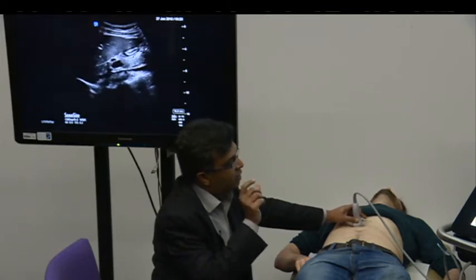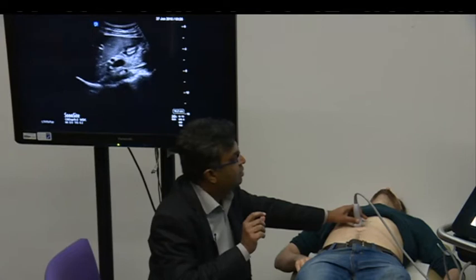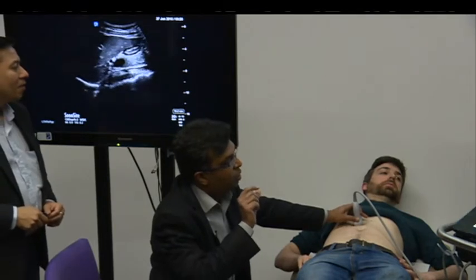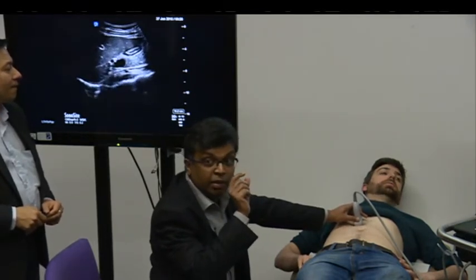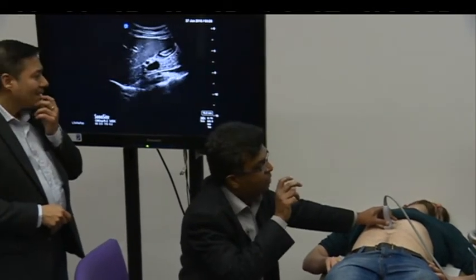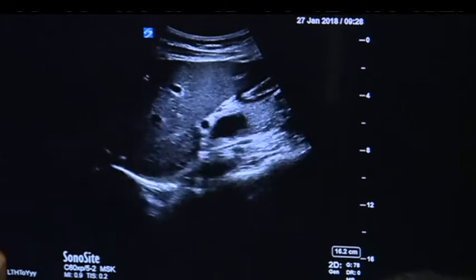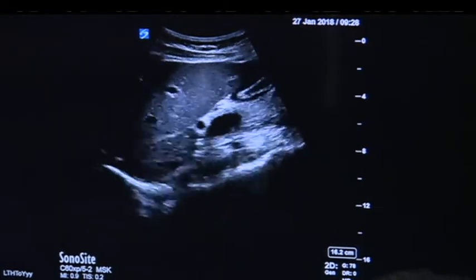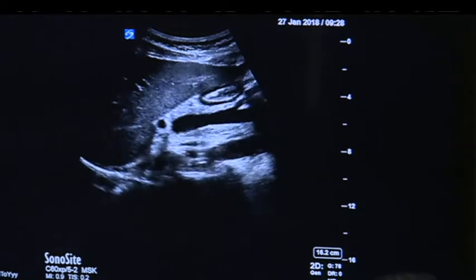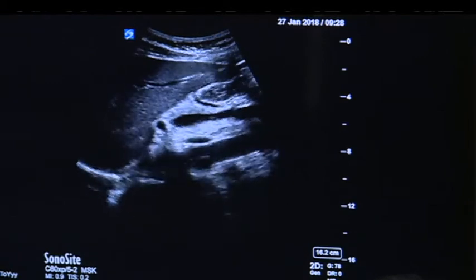Can everybody see it? That is the stomach. The stomach has got a very thick muscularis propria - the wall - and that is what is seen as a black ring. It is like a black ring, and inside is your gastric mucosal interface, which is showing as white. You can scan along the path of the liver. Just underneath that is your superior mesenteric vessels, then the white structure is the pancreas, and below that is your aorta which is pulsating.